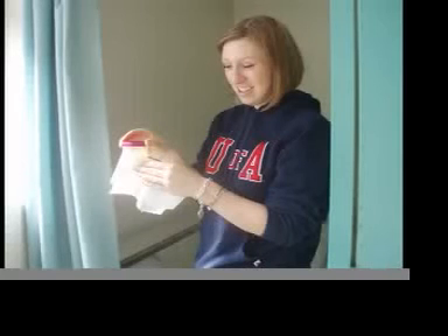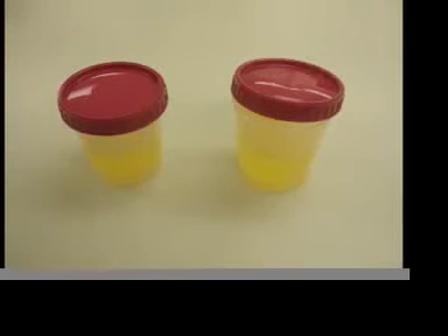Please be sure to wipe off any excess urine from the outside of the cup before you put it in the outer bag. Please screw the lid on properly and tightly, like the container on your left, so that it will not spill during transit.